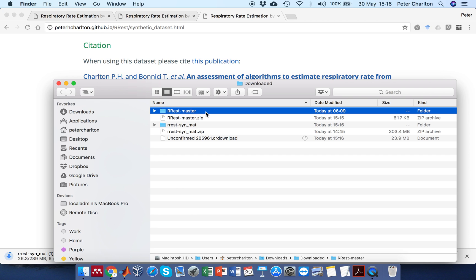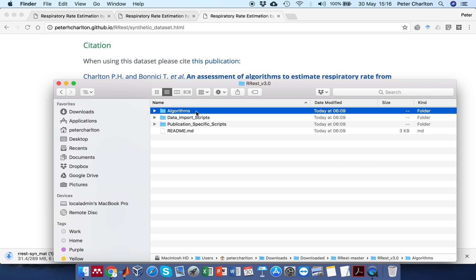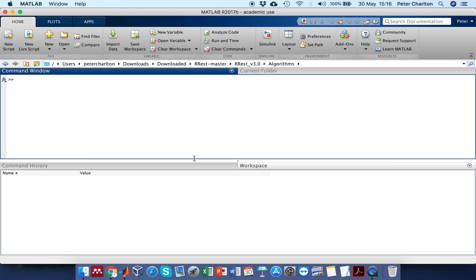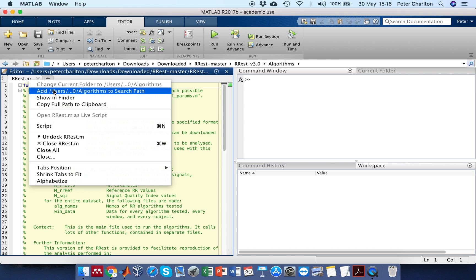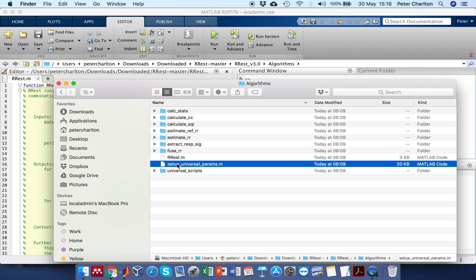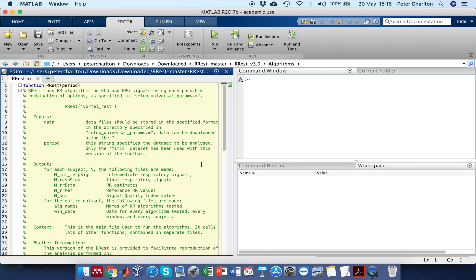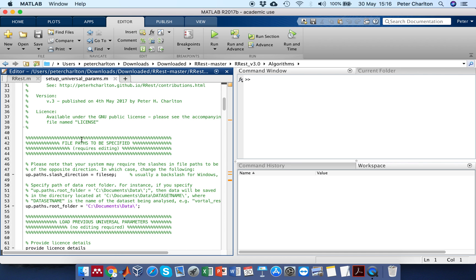I'll then prepare the algorithms. The latest version is currently version 3.0. Firstly I'll add the main script, which is RRest.m, to the search path. And secondly I'll make an adjustment to the universal parameters script which will be required for your computer. Scrolling down, there's a section called file paths to be specified.